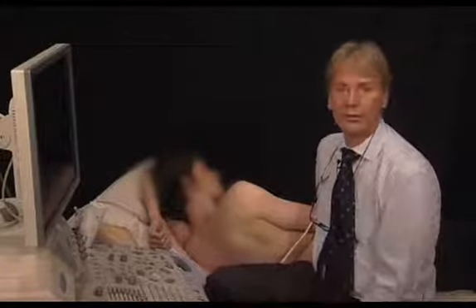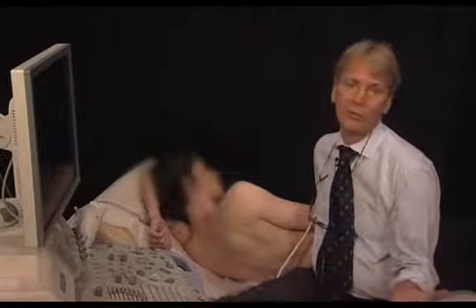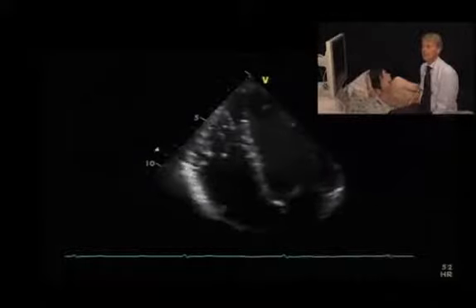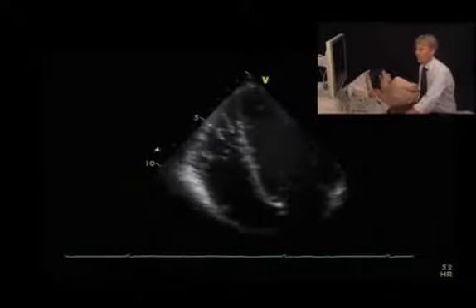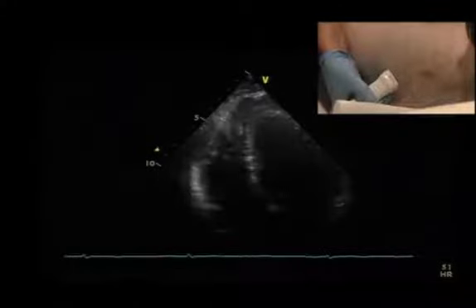From the apical view of the right ventricle, we can also assess the different walls of the right ventricle. Similar to the left ventricle, where we perform a two-chamber view and an apical long axis view, we can do the same for the right ventricle as well. To get such a view, it is important to first try to bring the right ventricle into the center of the image.